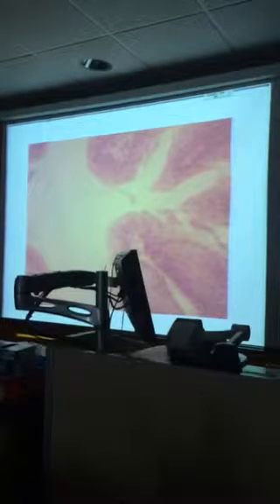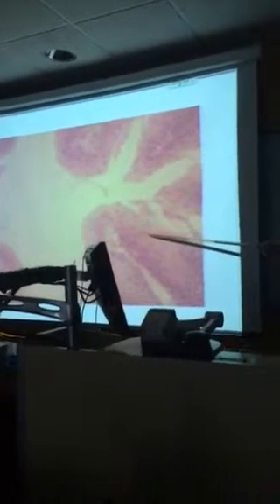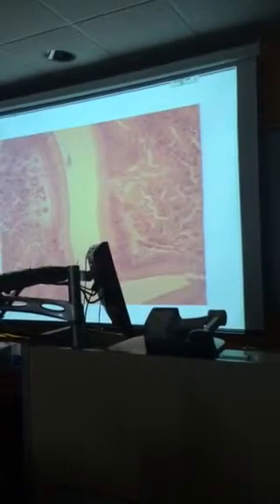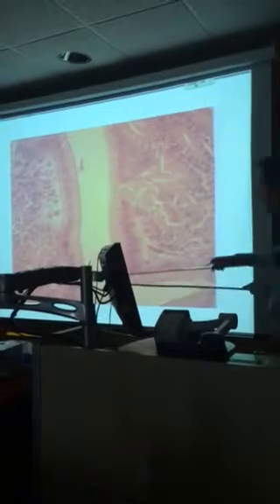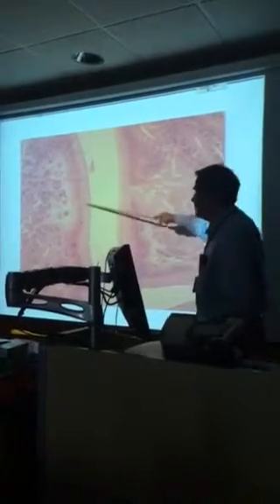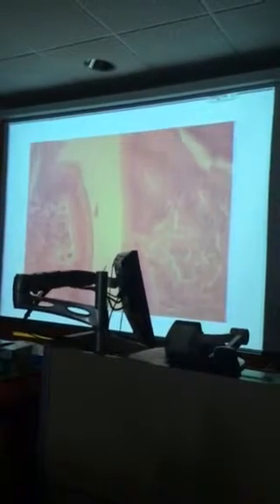So it's looking at a little higher magnification. And again, here's the non-keratinized stratified squamous. You can see the multiple layers of flattened nuclei indicating flattened cells. And then down here you can see a single layer of nuclei and the roughly oval, tightly packed cells of the simple columnar epithelium of the stomach. You can see it over here too.